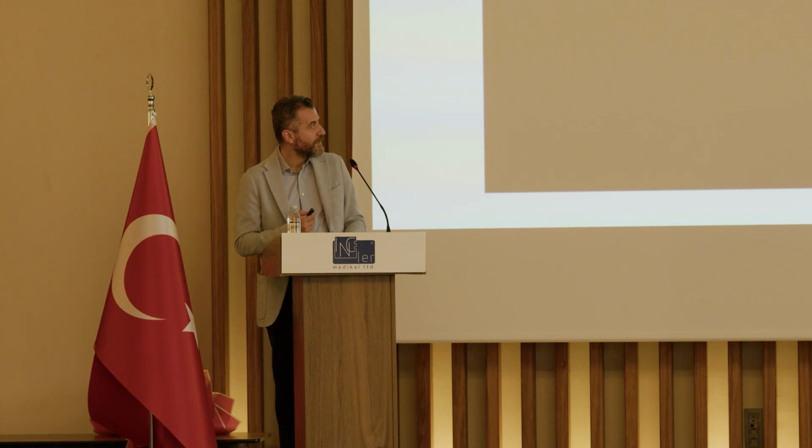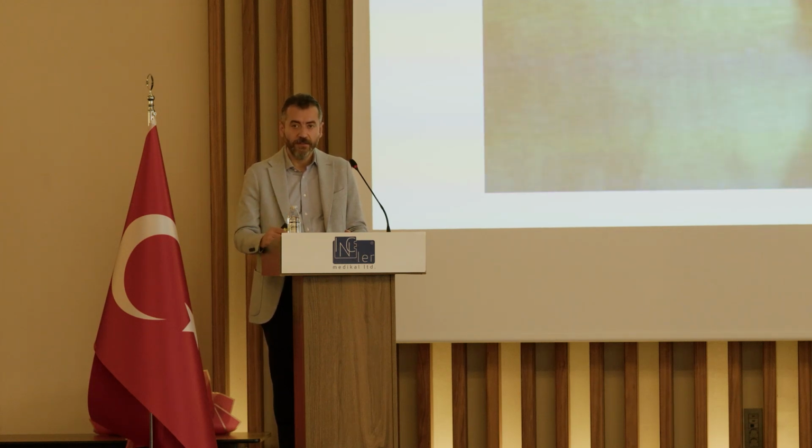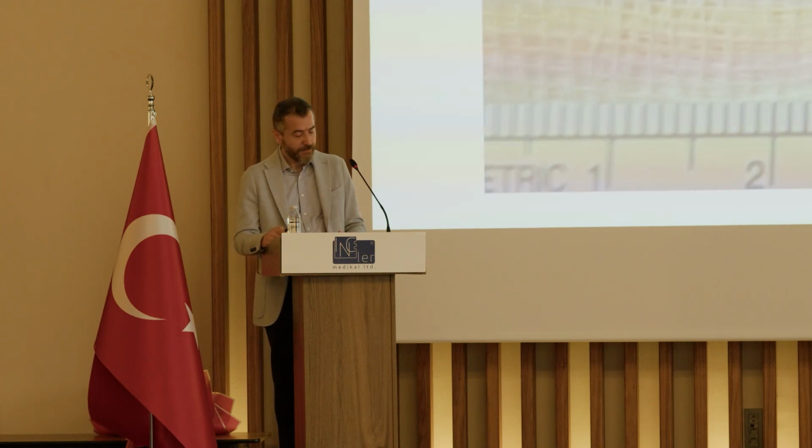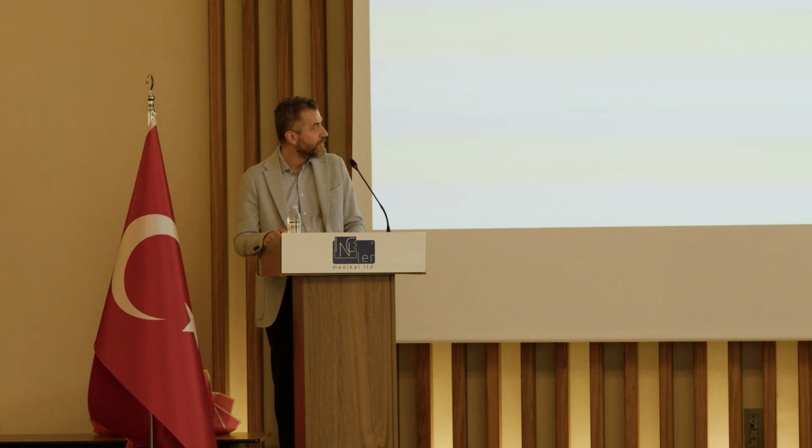You see, these are really hard stones. Also in Turkey, we have a lot of big and hard stones in the stone belt, especially the southern part of the country. The patients come from the southern part, also from the Arabic countries. They are really huge and very hard stones. So in the end, in order to be successful, we definitely need to be fast in the operation, especially with the fragmentation.